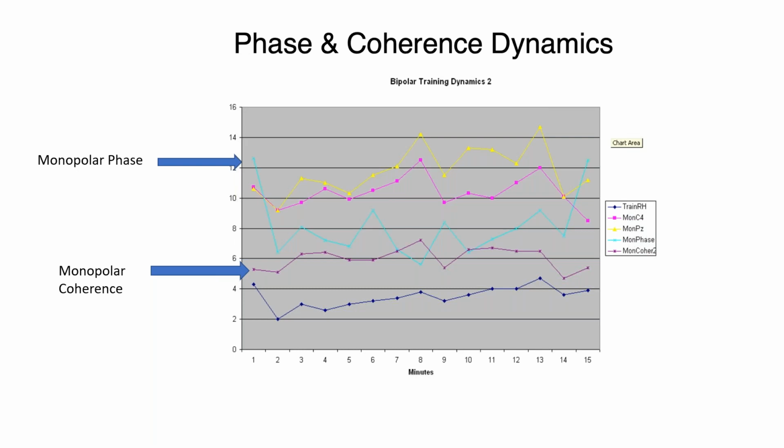And we're getting there. And we thought it was more important to implement proportional training because of the research that was done with mind over chatter, and because it had been very effective in peak performance training in the research going back 20 years. And so we did that. And then we jumped to coherence training because of all the really powerful work that Coben had done with multivariate coherence. And we thought that was something. This is a lot more vague, a lot more gray area, and requires a lot more study and investigation to really track.